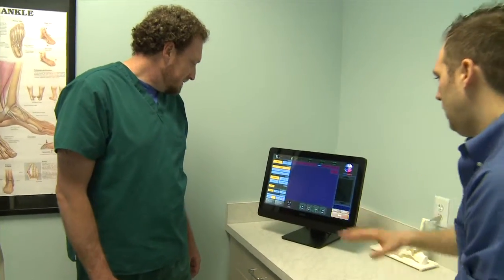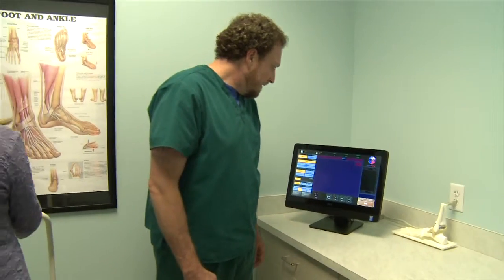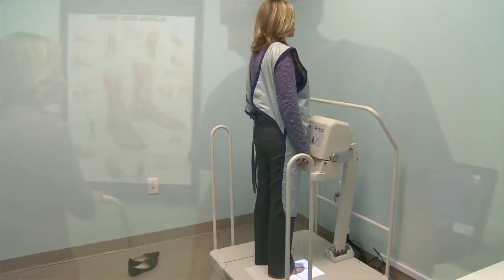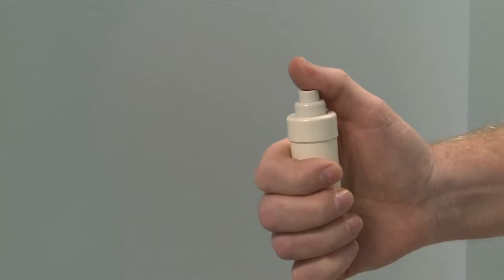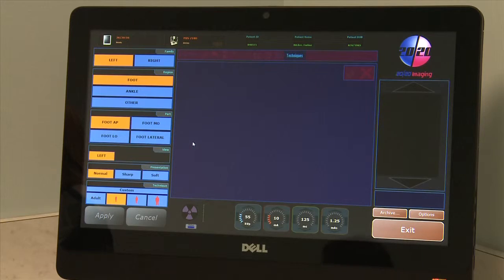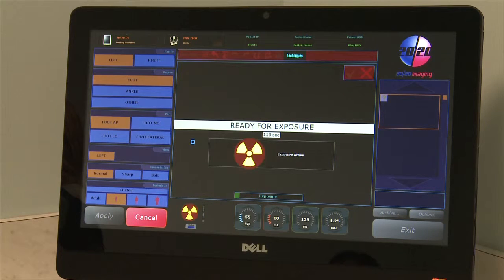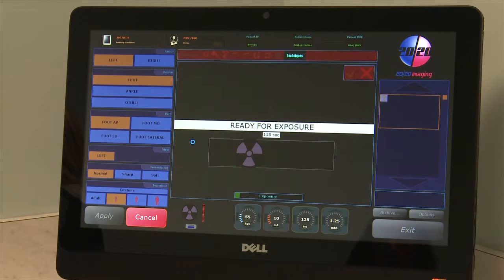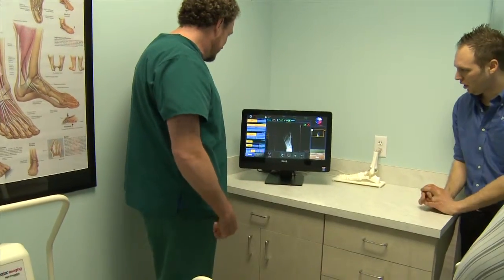Once you're ready, that's all you have to do on the computer. We're going to take this x-ray — step out, then hold the button down halfway until it says Ready on the screen. It takes a second or two, then you can press and the x-ray comes up on screen.